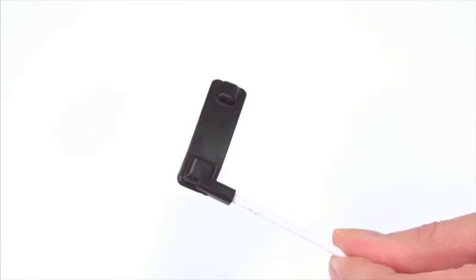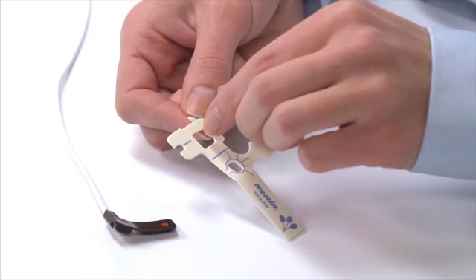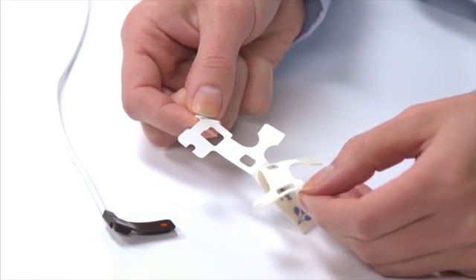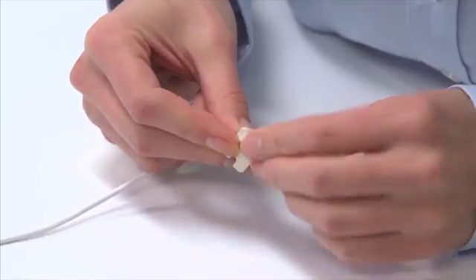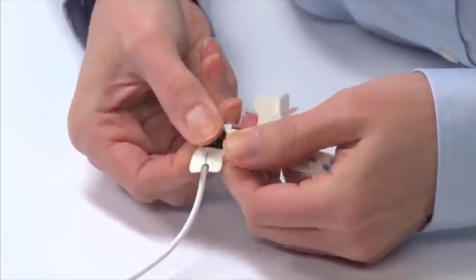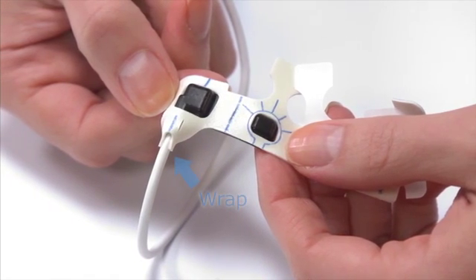Make sure the sensor is clean and free from adhesive or debris from previous use. Partially peel back the adhesive backing tab on the FlexiWrap so the sensor area adhesive is exposed. Align the sensor emitter and detector, skin-contacting side up, to fit in the cutouts on the wrap. Then gently press the sensor into place on the wrap. The cable should extend beyond the wrap, supported by the adhesive and tab on the wrap. Remove the adhesive backing from the rest of the wrap.